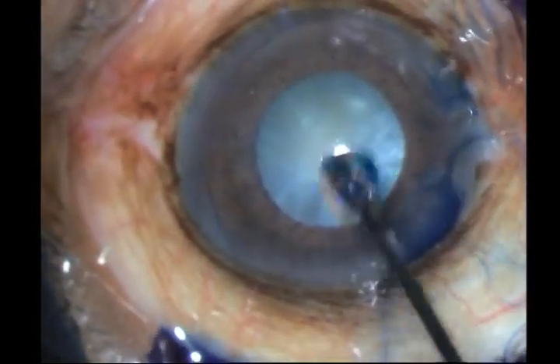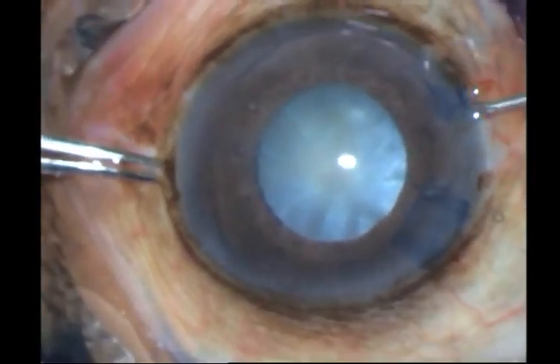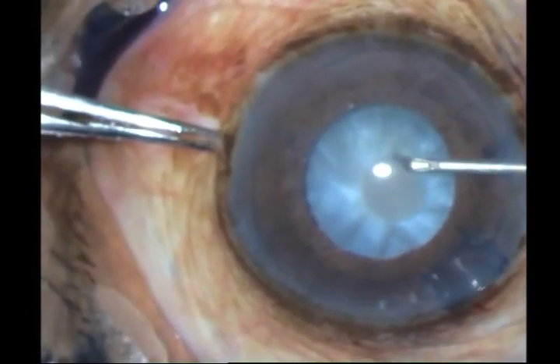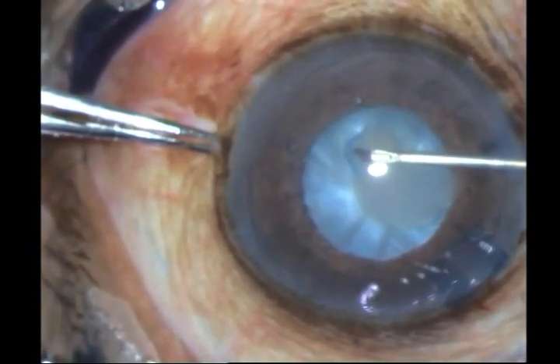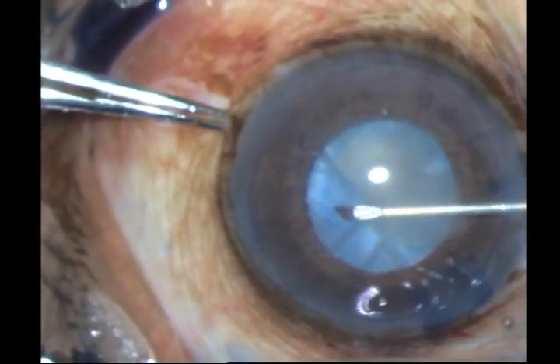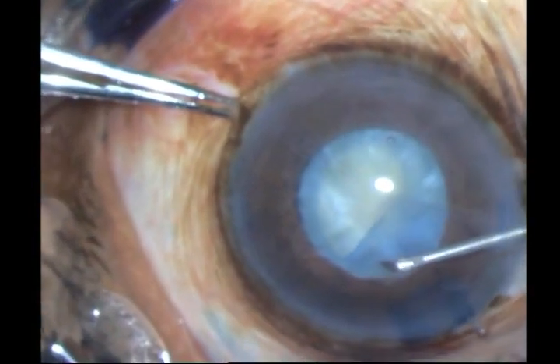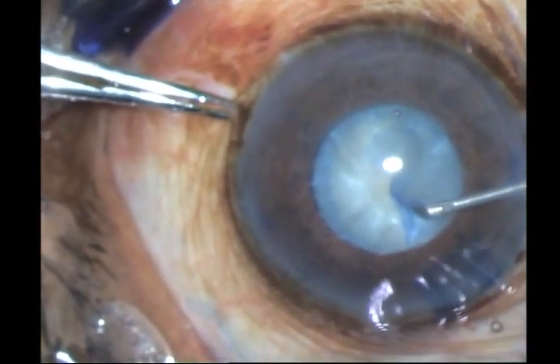Taking my bent 26 gauge needle, I go ahead and perform my rhexis. Now watch carefully — I am not coming out. There is an egress of fluid but I think I can manage. As long as you do not lose the anterior chamber and very carefully go around, you can manage. Otherwise it is a better idea to do a small rhexis and treat this as a potential Argentine flag sign cataract and do a double rhexis.